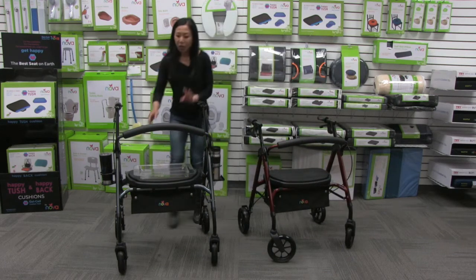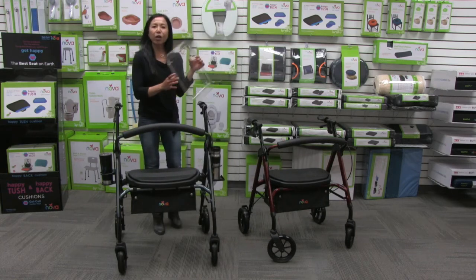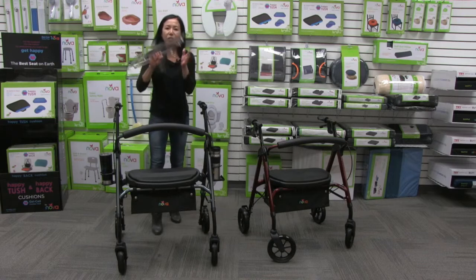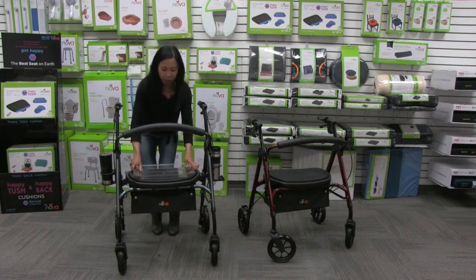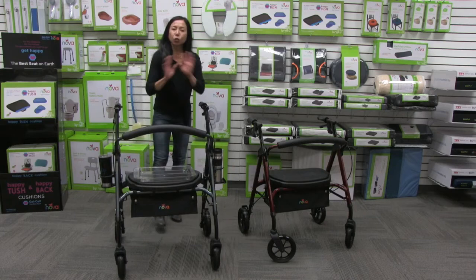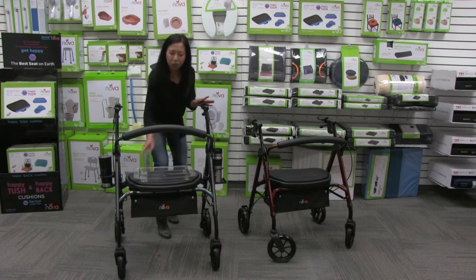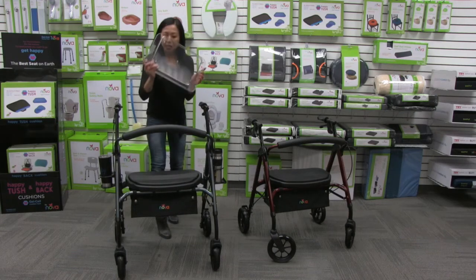The built-in comfortable seat pad has an option for a food tray or a personal tray. This tray just fits right on to the seat and it's nice and secure. It's great for transporting food, or you can put your cell phone and keys on it. It's such a great option and it's so easy to get on and off.